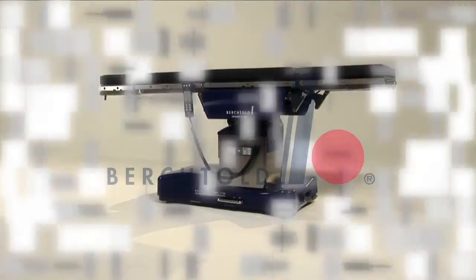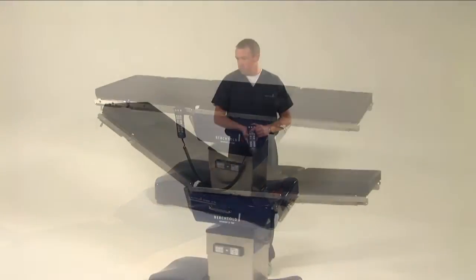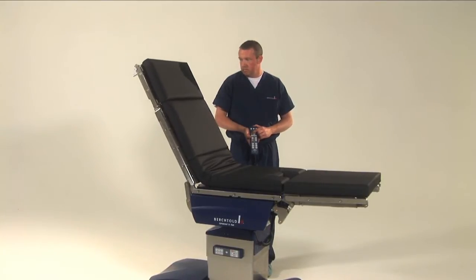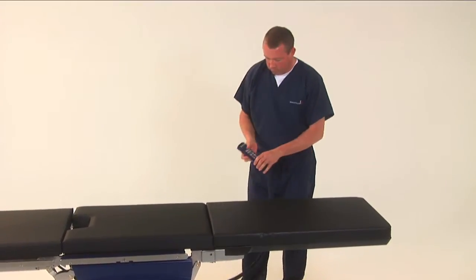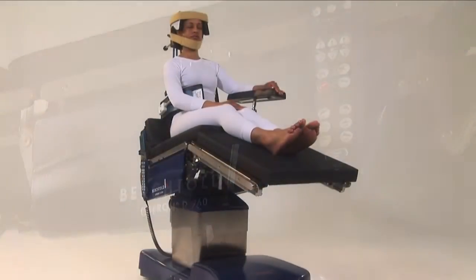The Berktold line of Operon surgical tables are synonymous with quality, durability and flexibility. Each Operon table is specifically designed to provide maximum patient positioning options during surgical procedures, as well as superior imaging access. The D760 surgical table offers Berktold's trademark surgical table innovations at an affordable price.